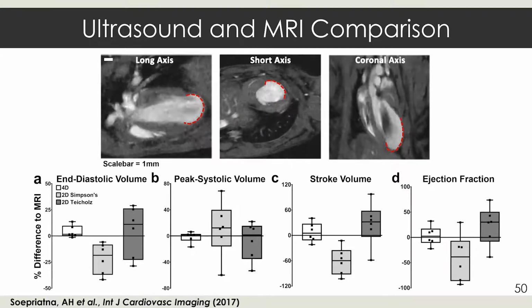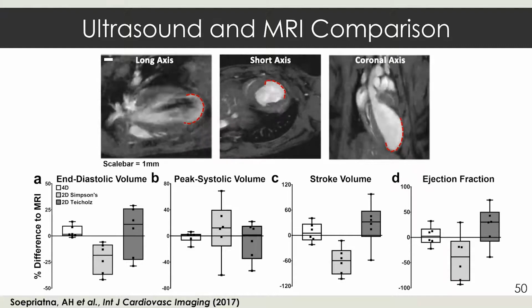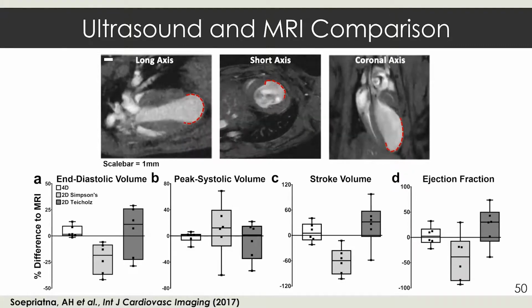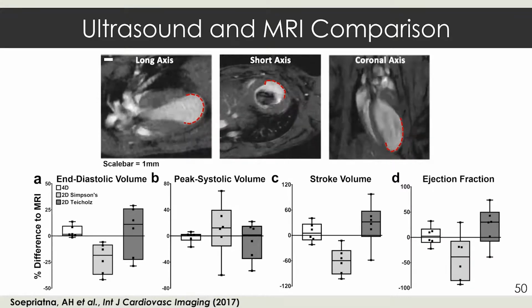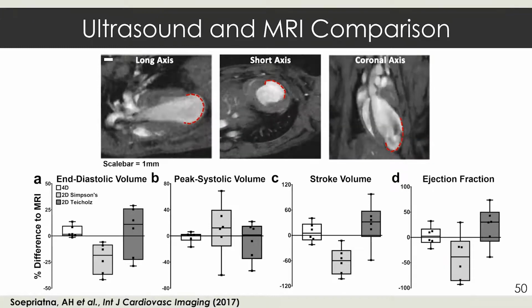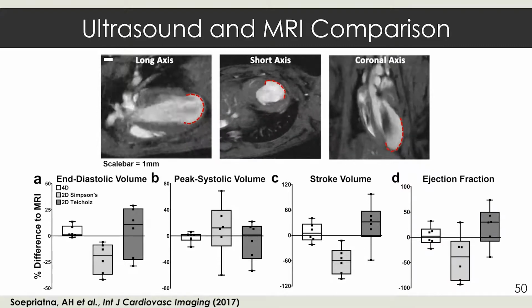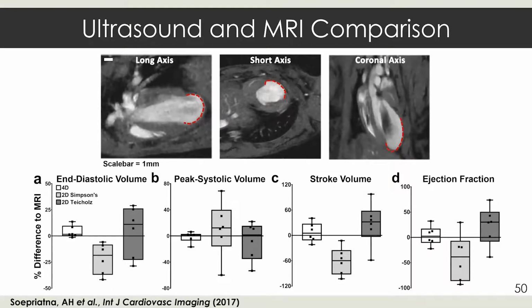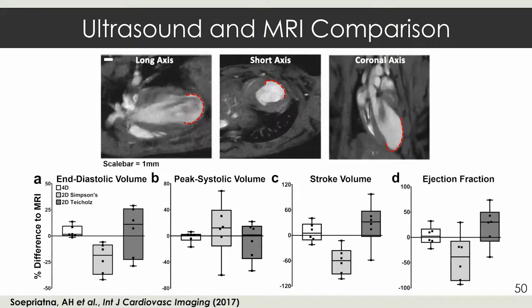Yeah, and it also brings an interesting point, like the trade-off between how much data you want to collect and the resolution of your final strain. So what I did is I used the limit of the minimum elevation resolution of the transducer to guide my step size. But you don't really need that fine detail if you want a coarser estimation of strain. We just wanted to get as high resolution as we can, so that's why our acquisition time is also longer, because we wanted to get as much data as we can from these ultrasound data.